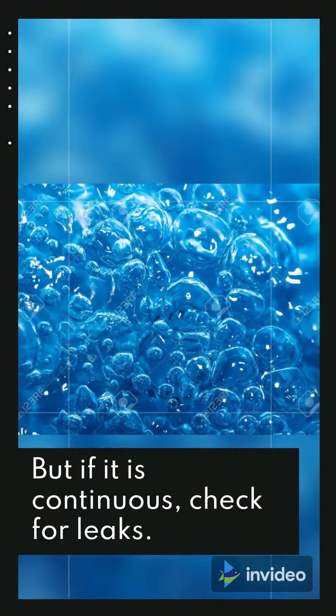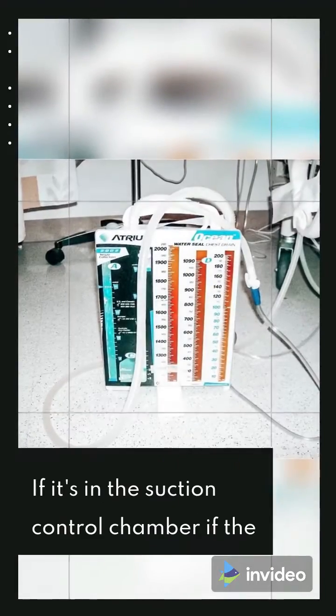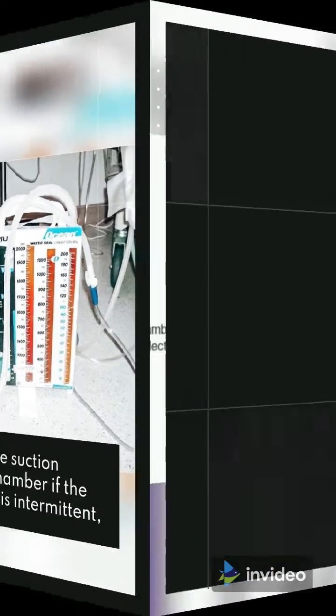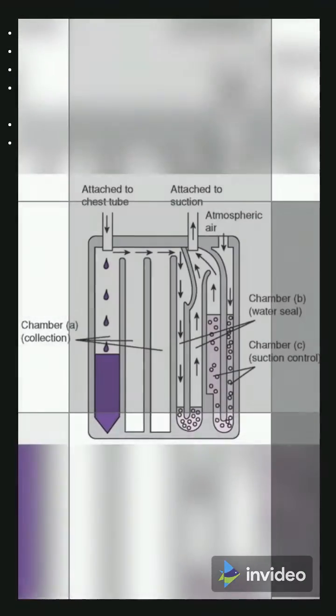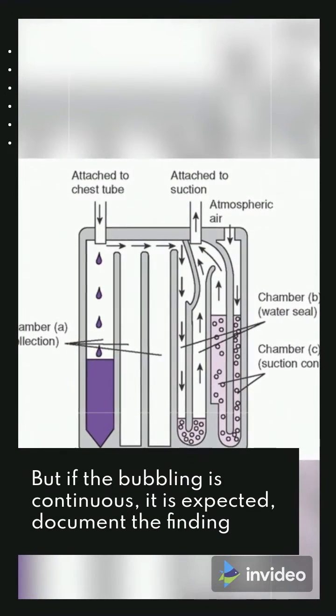But if it is continuous, check for leaks. If it's in the suction control chamber, and if the bubbling is intermittent, increase the suction, it is probably too low. Lastly, if the bubbling is continuous, it is expected, document the finding.